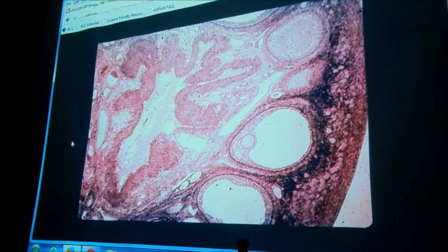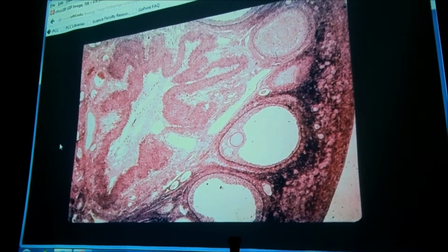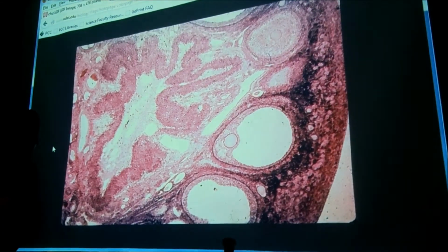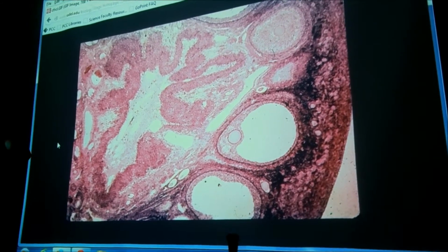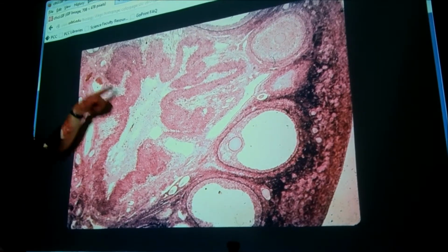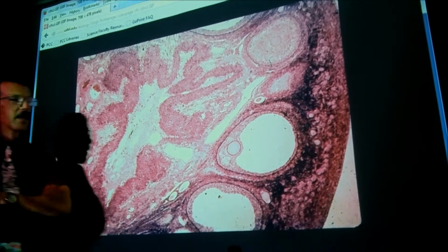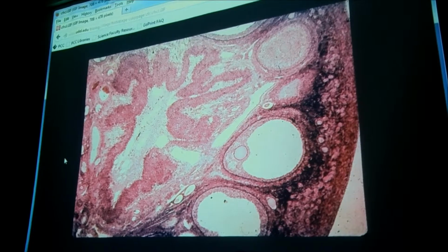The thing on the left is what I'm interested in, not the things on the right. Corpus luteum. How did you know that was a corpus luteum? It looks like one. Indeed. Corpus luteum, they look puffy, cloud-like. They don't look like round follicles. That's the old follicle. When this egg left, or will leave, they'll get this. So there's a corpus luteum. They look puffy, cloud-like, some people say. Corpus lutea there.